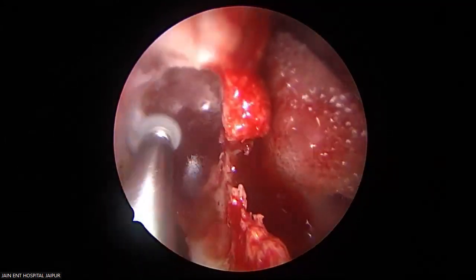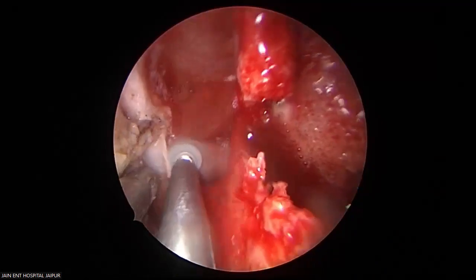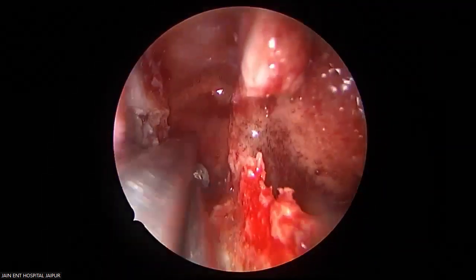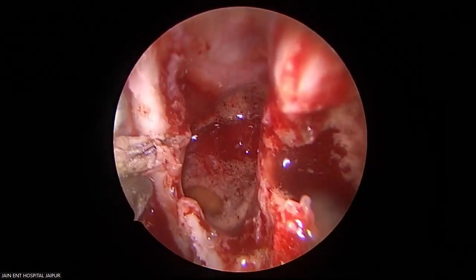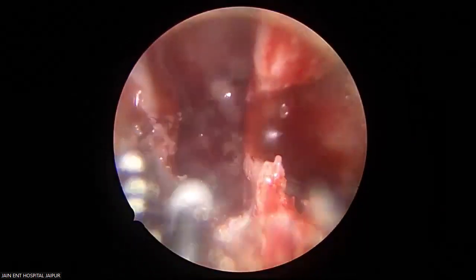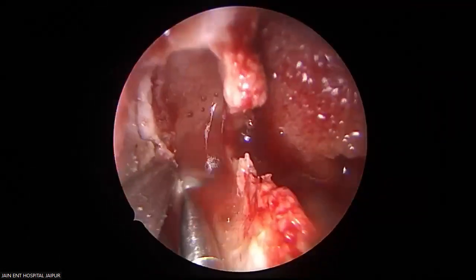See, now more bone is exposed, more bone you can remove. Move complete, even if you want to complete the anterolateral wall. This is my left infraorbital now. See there. That's the canal laterally. Here I am not going lateral to it.